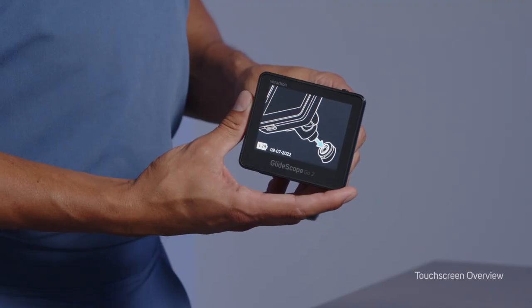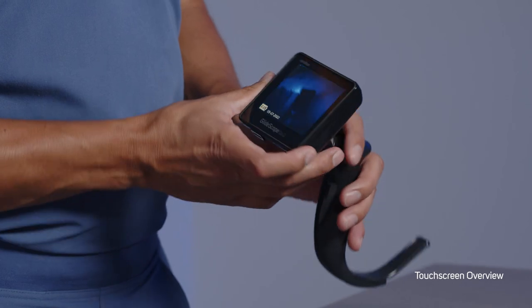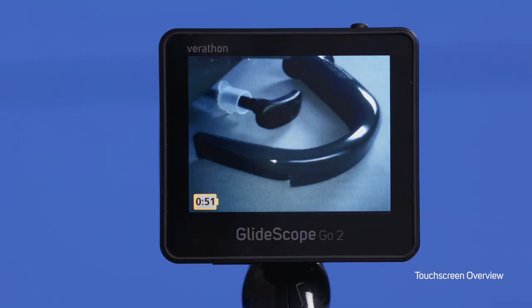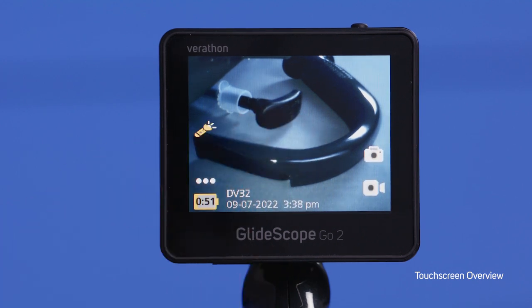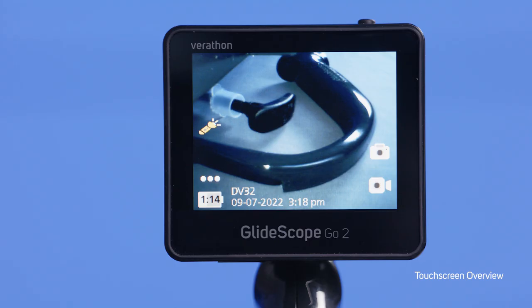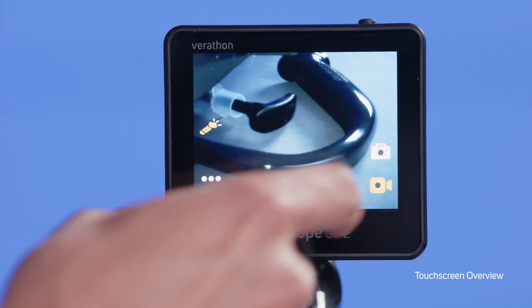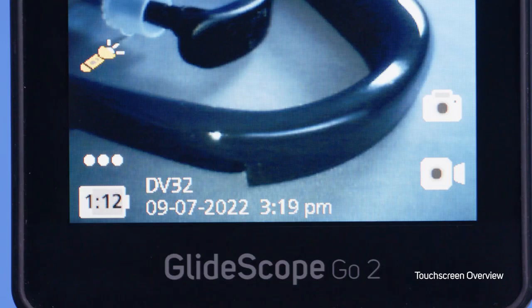After you've turned on your monitor and attached a blade, your touch screen will activate. The battery indicator will always be in the bottom left-hand corner and tells you how many hours and minutes you have left of battery. If you touch the screen, more icons will appear. On the right side of the screen, the camera and video buttons will appear. To take a picture, click the camera button. To begin recording a video, click the recording button and click again to stop recording. To the right of the battery indicator along the bottom, the device name, date, and time stamp appear.